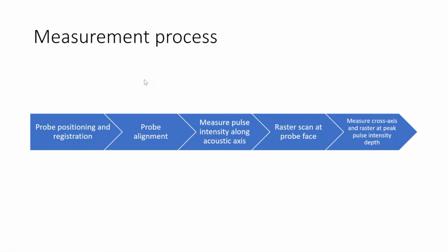The high voltage supply of the ultrasound system may not be adequate to go to a higher level than that on a particular probe. And it's also, the ODS value is showing you the mean. So if they have high variability between probes when they're being tested and the standard deviation is higher, they don't want to give an output which, with the variation, does get higher. So they're showing you the mean value, even if the true value might be slightly higher. Right, that's an excellent point. The ODS values displayed are the mean or average expected values across all probes and equipment distributed to users.